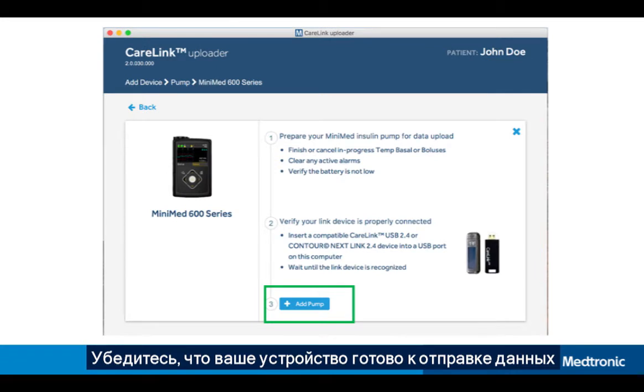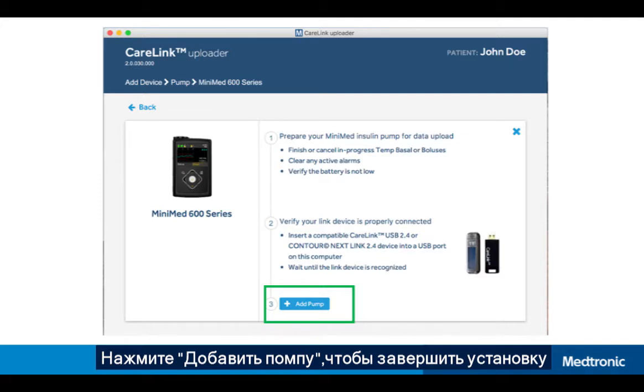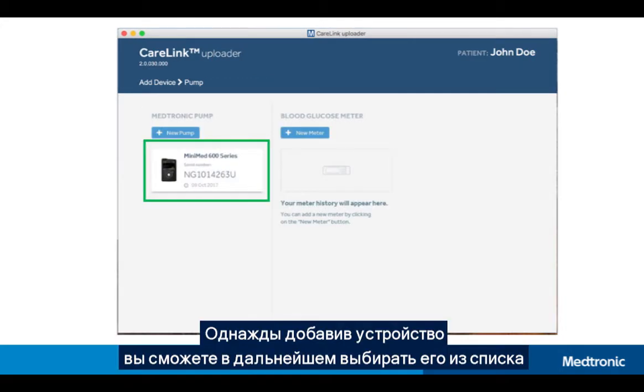Make sure your device is ready by reviewing the checklist on the screen. Click Add Device to complete setup.